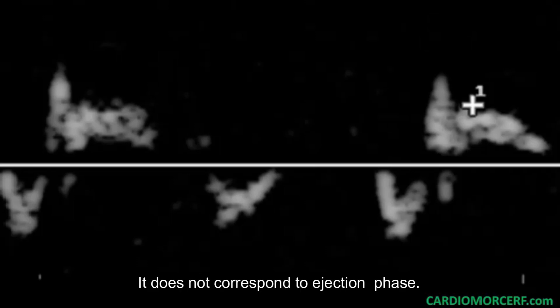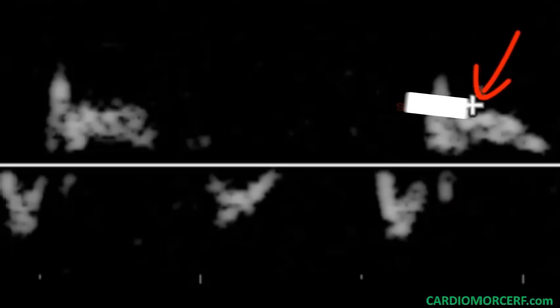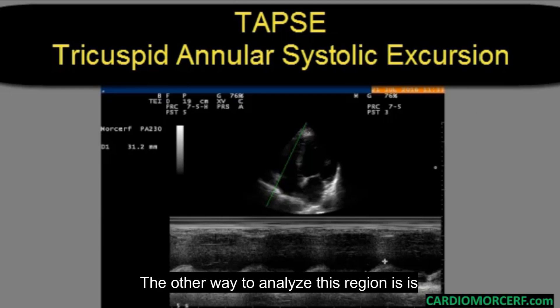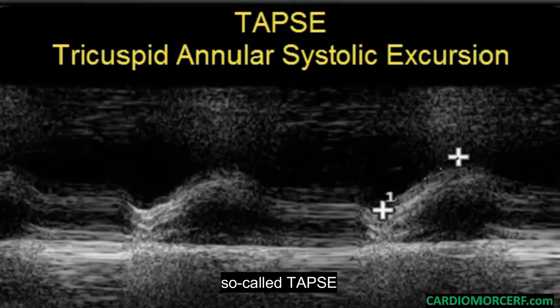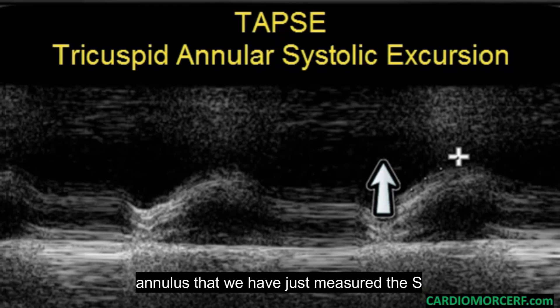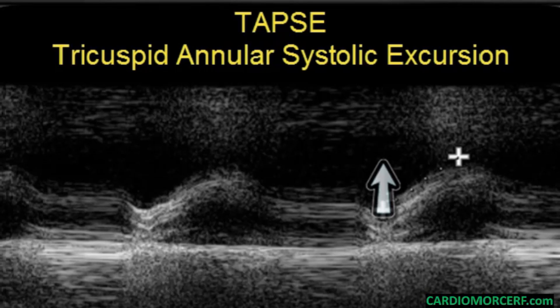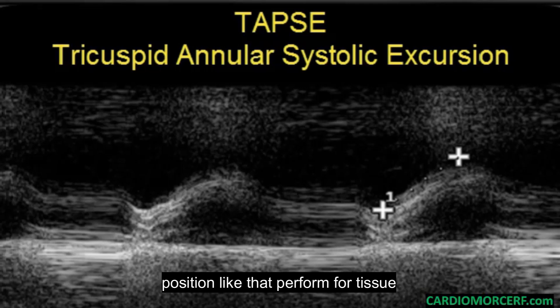The isovolumetric contraction peak does not correspond to the ejection phase. It is easy to recognize that it is not the S prime because it is composed of two waves — one positive and one negative. S prime is the one that follows the negative wave. The other way to analyze this region is by measuring the tricuspid annular plane systolic excursion, so-called TAPSE. It is the displacement of the tricuspid annulus that we have just measured with S prime velocity, and it is widely used. We measure with one-dimensional echo the plane of the annulus with the cursor in a position like that performed for tissue Doppler.